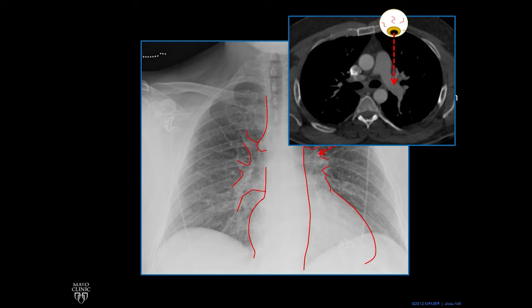That's the left pulmonary artery. The right pulmonary artery, which we see partially, runs more or less right to left in front of the trachea.